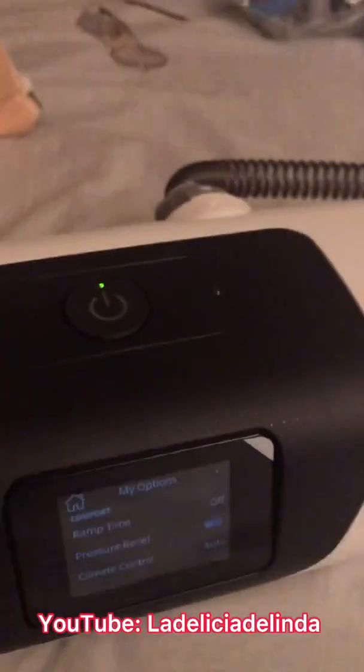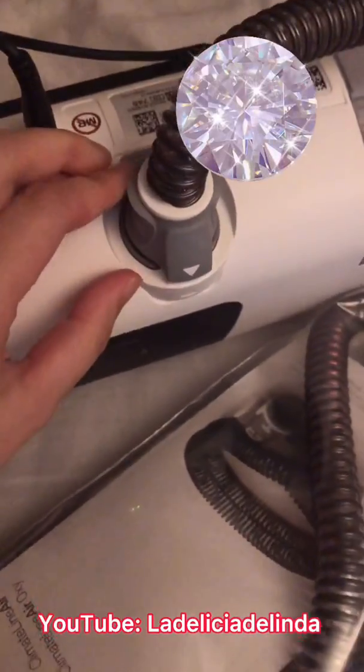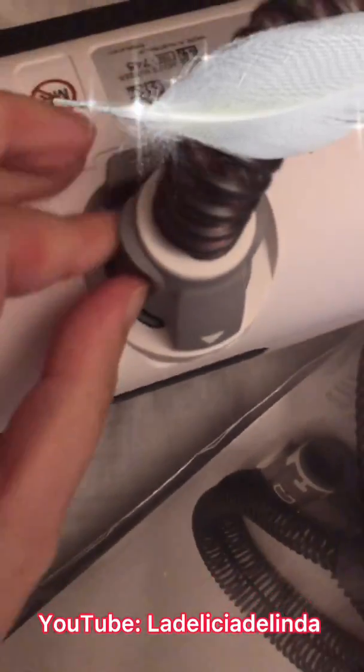This is the heated tubing for the AirSense 10 — the knob is bigger, slightly different. If I try to put this on my 11 it will not fit into the port where your tubing goes in. The AirSense 11 heated tubing versus the 10: the input on the 11 is slightly smaller, and the 10 is slightly bigger with extra pieces on the side.